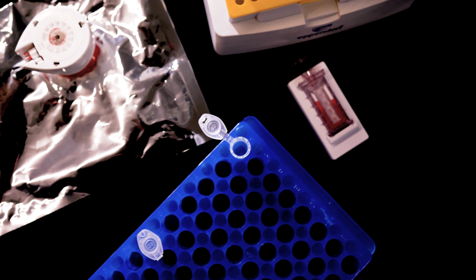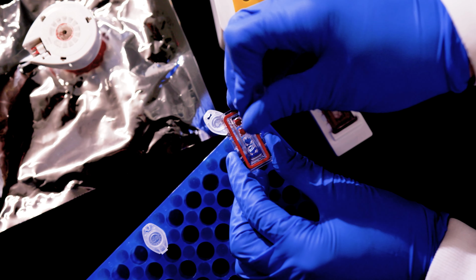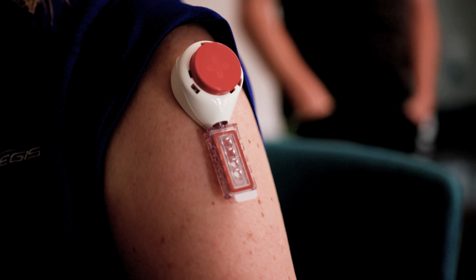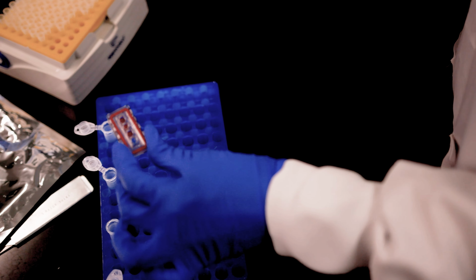One of the things that we're most excited about is changing the experience that athletes have around blood collection. Specifically, this includes new ways of collecting blood called dried blood spots. This is a way of collecting blood rather than sticking a needle in an athlete's arm. We can collect a small amount of blood through a device that either pricks the finger or actually attaches to the skin on the athlete's arm. We can collect about 20 times less blood than we're collecting now and analyze that for prohibited substances and be able to effectively detect those substances in a much smaller volume.